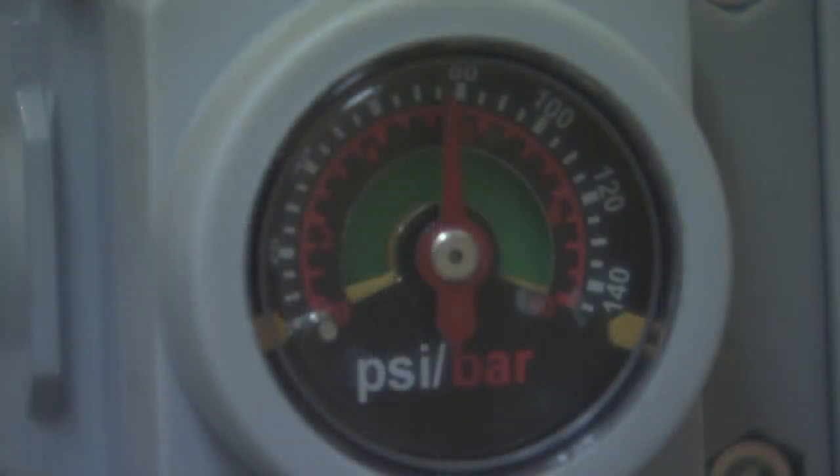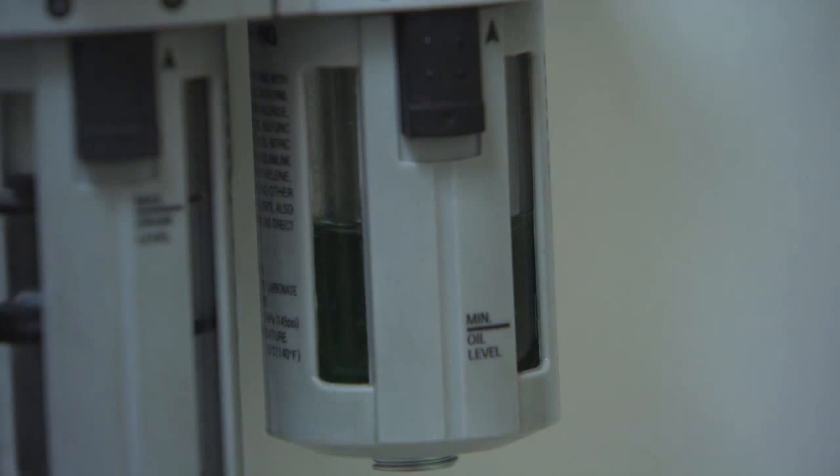First, adjust the static air pressure to approximately 80 PSI. Next, check that the spindle oil is above the minimum mark on the reservoir.